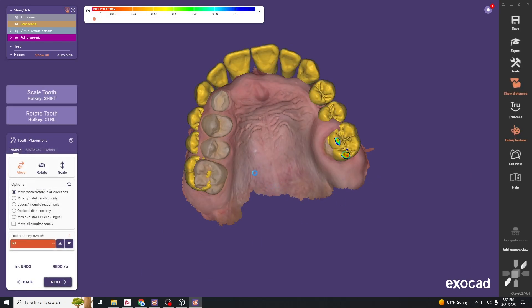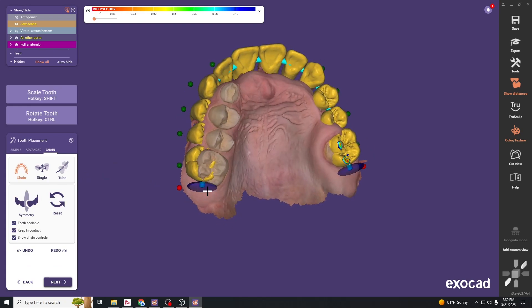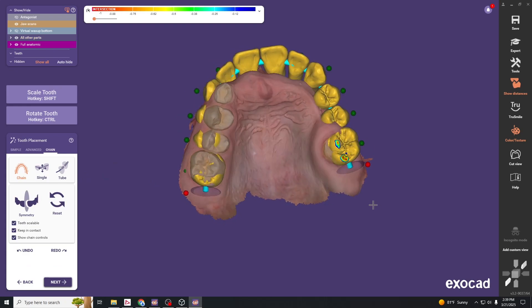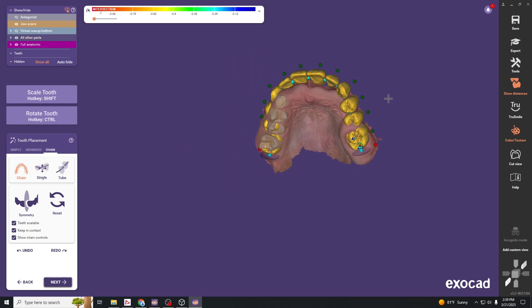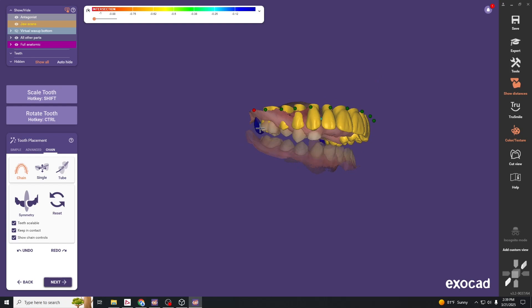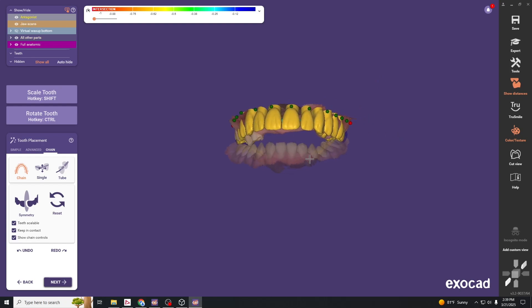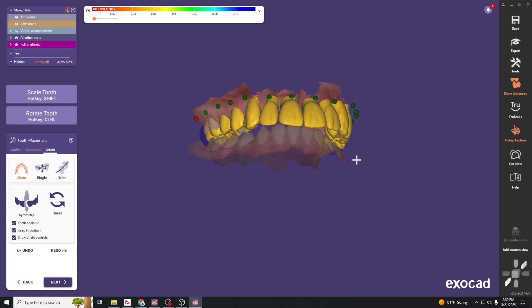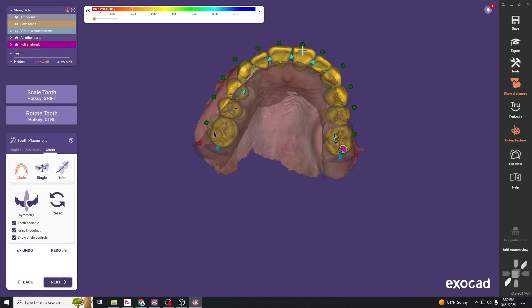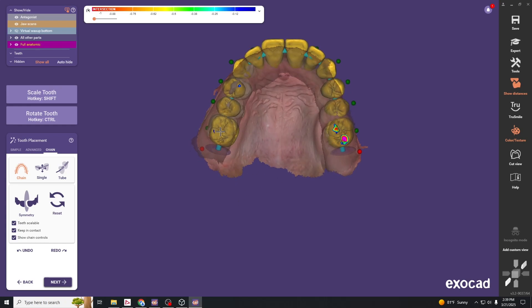Hit next — this jumps into the tooth placement tab. In chain mode you can quickly move all the teeth in a segment. Look from different views and put the teeth closer to where they should be. You can do the major movements using this chain tool; there'll be other features later to fine-tune, but let's get into the ballpark first.